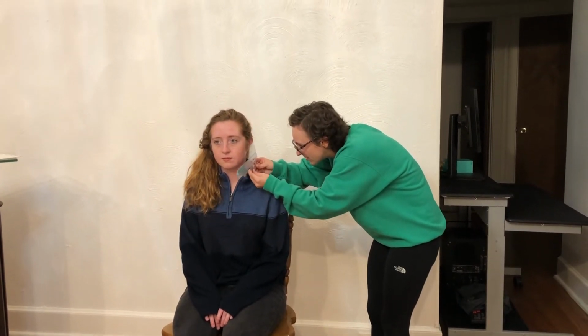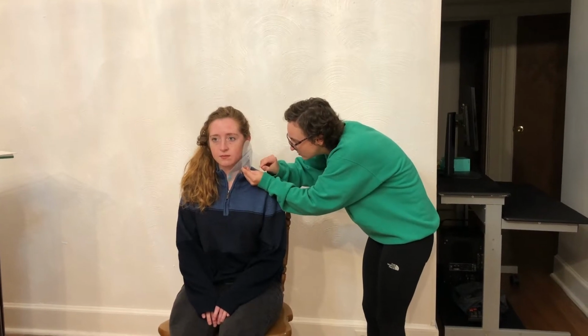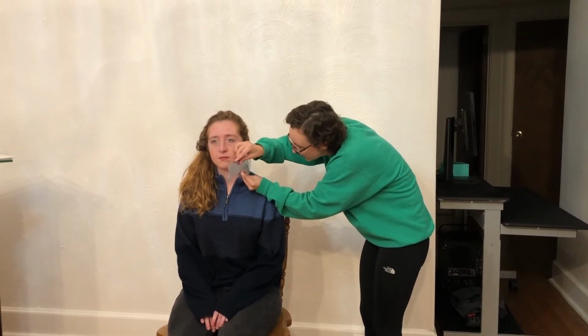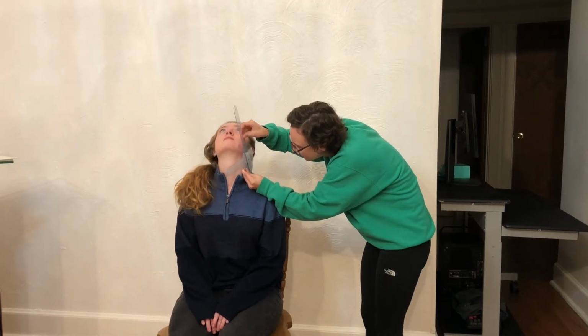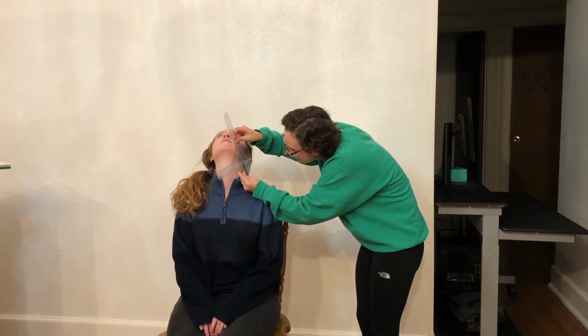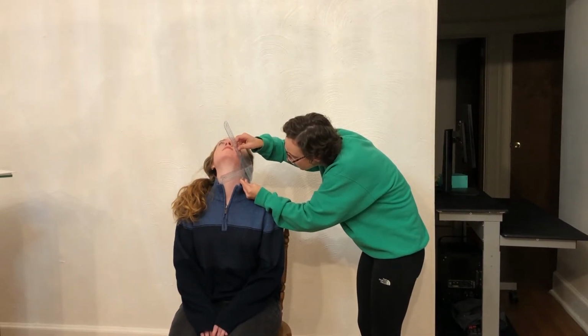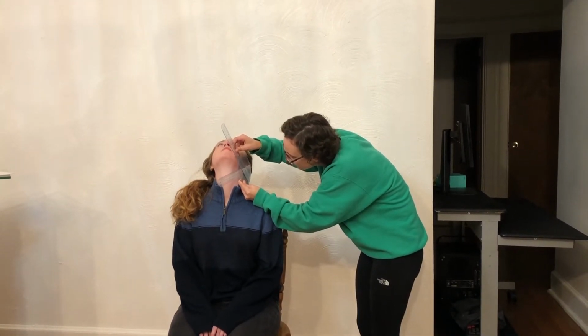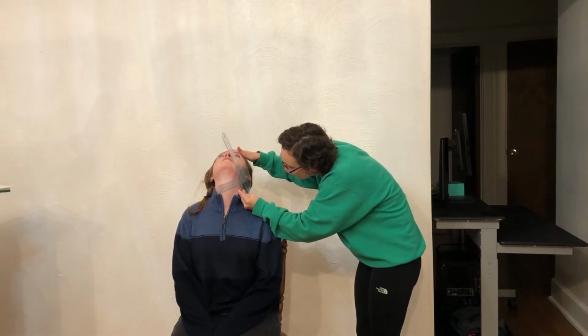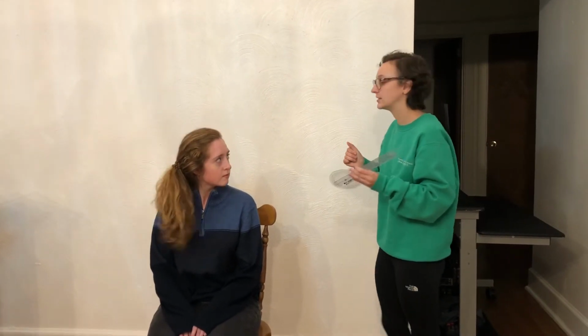Okay, and now for extension, go ahead and just go right back to normal there. Again, lined up with your chin there. And what I want you to do is bring your head back as if you're looking up at the sky. And that's about 44 degrees, and 45 is normal, so I'm just going to see if I can get just a little bit more. Okay, fantastic. So that was cervical flexion and extension.